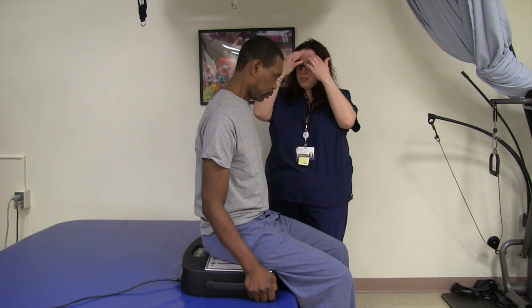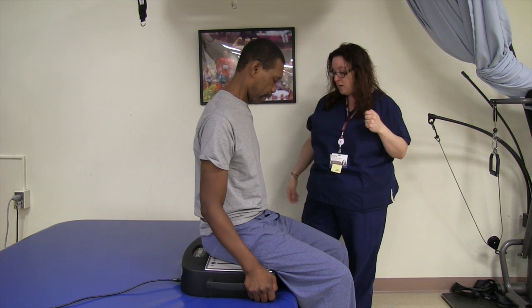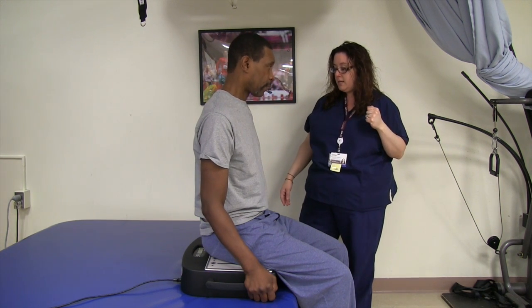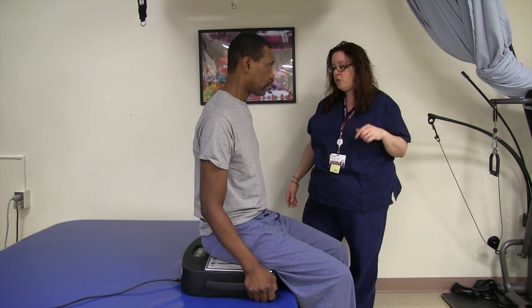Okay, so this is a Galileo — we use it a lot with stroke rehab, among other things. Right now you're sitting on it and we're going to work your trunk muscles to strengthen the muscles in your trunk.